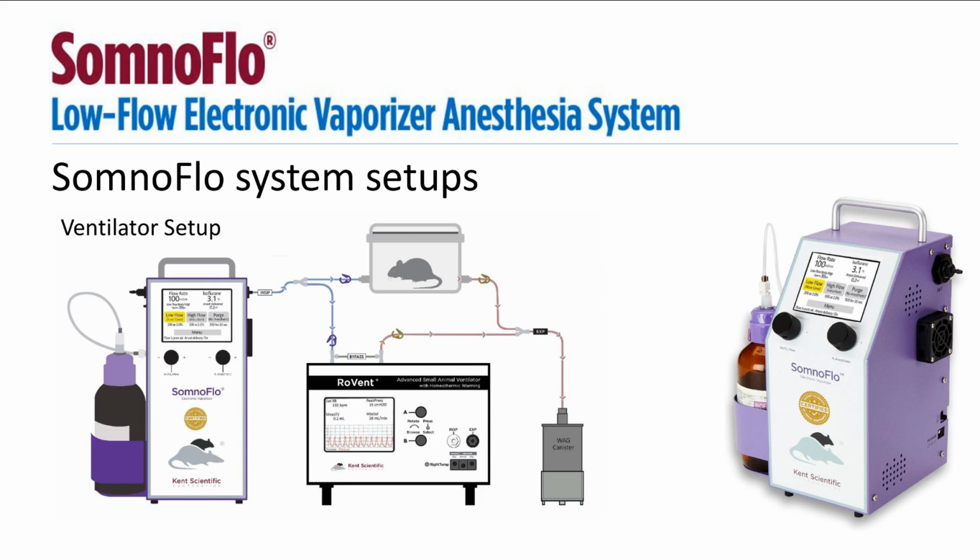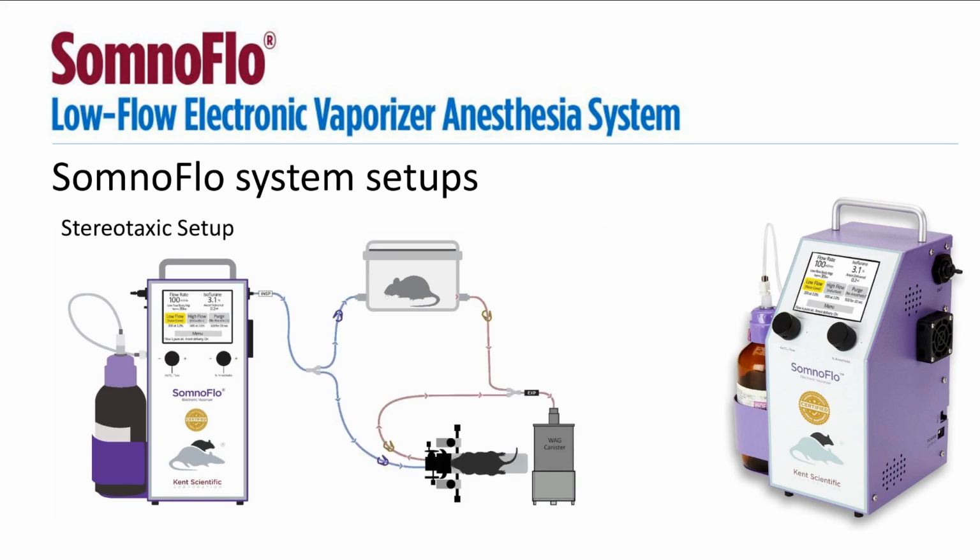And if you decide to use a ventilator for your studies, this diagram shows how you can connect the SomnoFlow to a standalone ventilator system. And if you are performing stereotaxic surgeries, the SomnoFlow can also interface with your stereotaxic frames using this 2 accessory adapter.